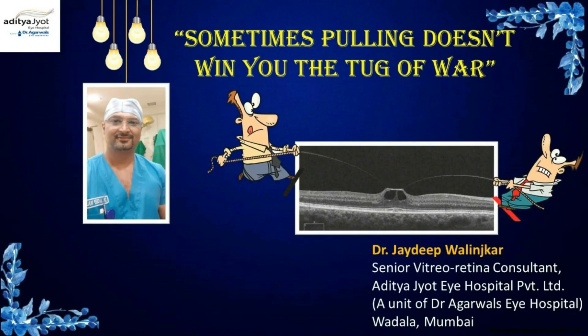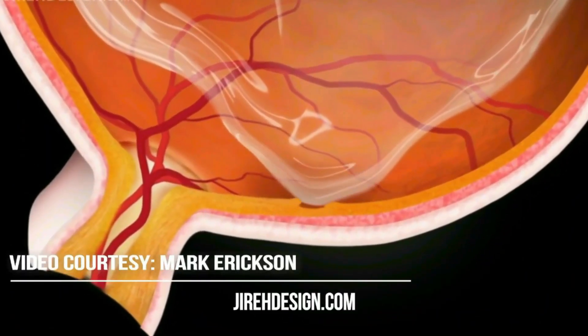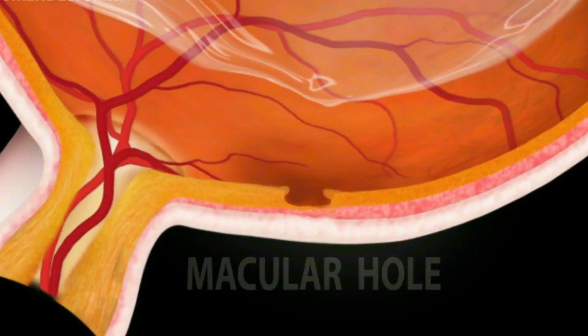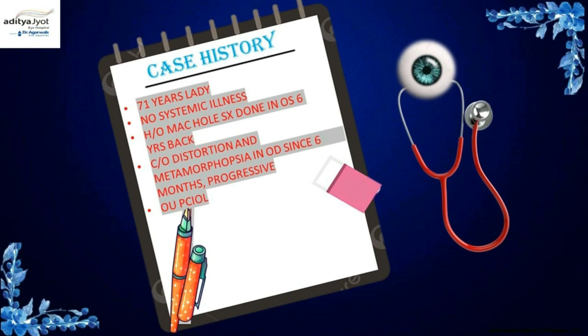The title of this video is 'Sometimes pulling doesn't win you the tug-of-war.' There is no financial disclosure. Many times while operating a case of vitreo-macular traction, by pulling at the vitreous we end up developing a full-thickness macular hole, resulting in a central scotoma to the patient.